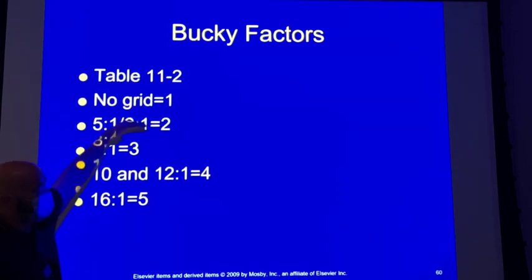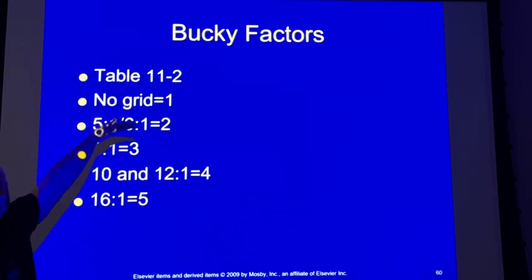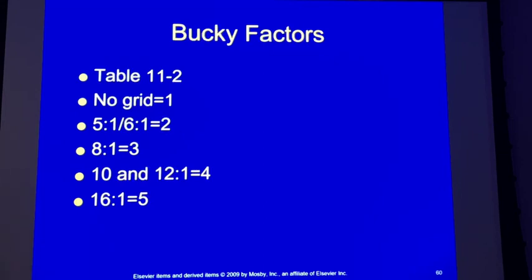Is there a point ever to using a low ratio grid? Mammo. Yeah, mammo would be one. What about in diagnostic? What tissues are more radiosensitive? I don't mean specific tissues, but what type of tissues? Developing or mature? Developing. Who has the most developing tissues? Peds, right? So in some of your pediatric hospitals, pediatric clinics, you're not going to see these high ratio grids, you're going to see these lower ones. Okay, 5:1, 6:1, something like that for your pediatric patients, just to reduce the patient dose.